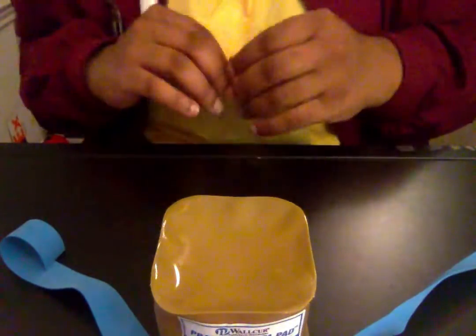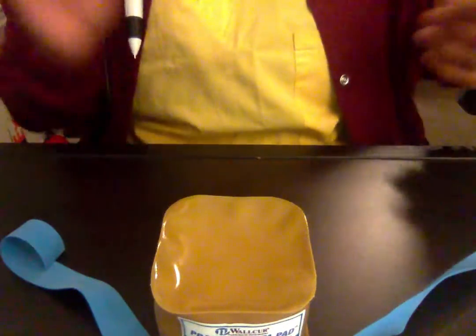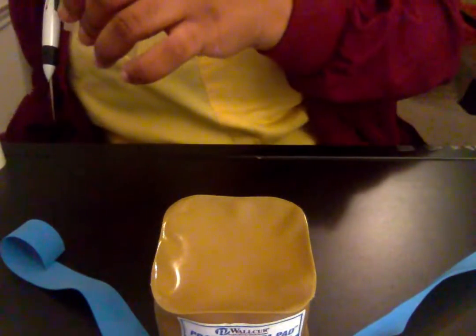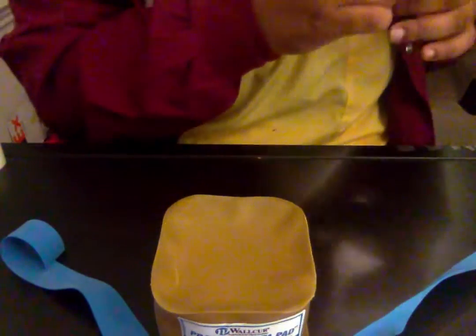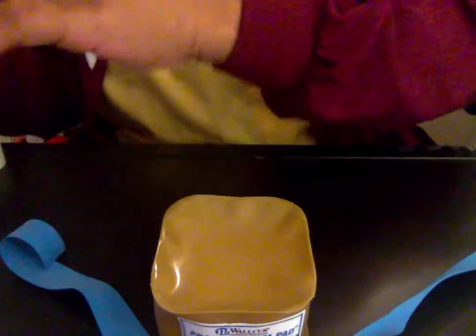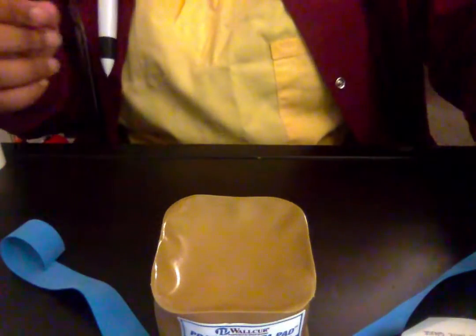And while that is drying, I'm going to get my stuff together. I'm going to be doing the tape. I'm going to take some tape out so that I'm able to secure my IV when I have it inserted. Okay. And just have those ready. Then I want to have my Tegaderm out and ready.